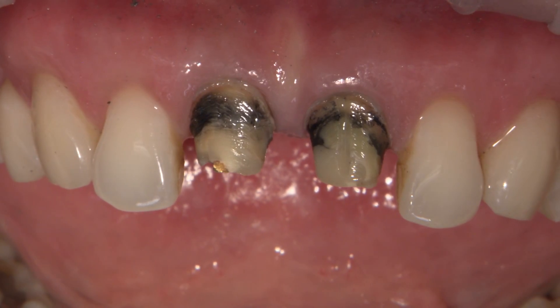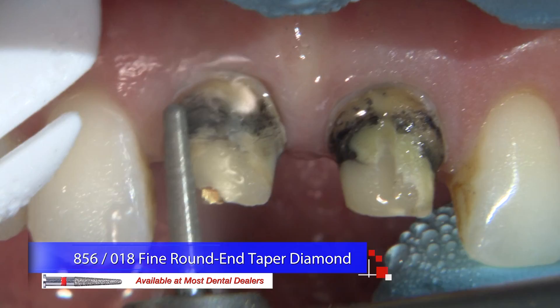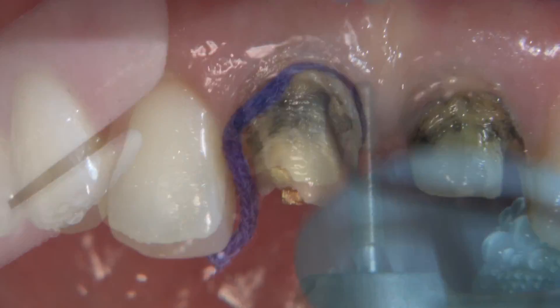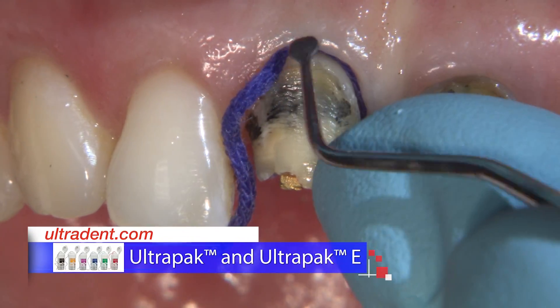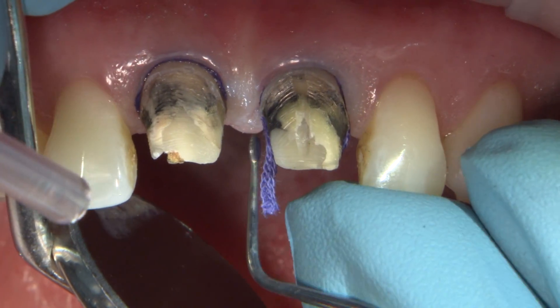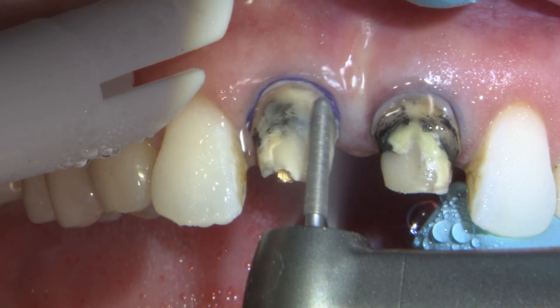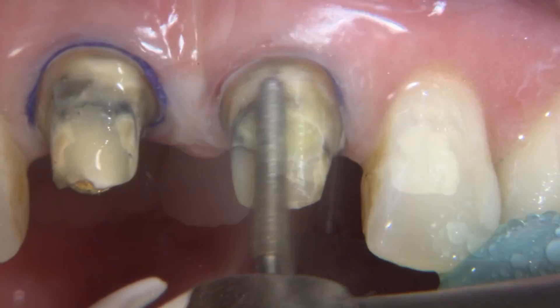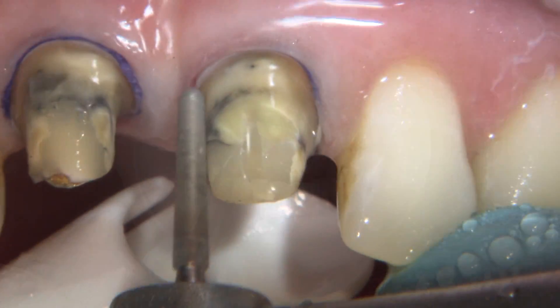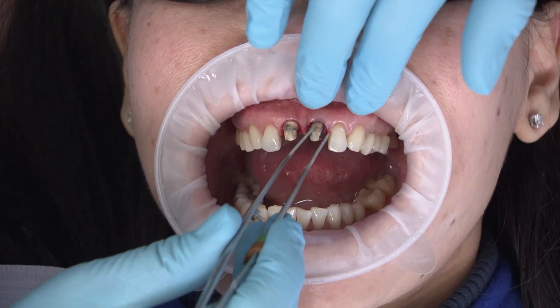Once the crowns are removed, she switches back to a round end tapered diamond 856-018 burr to smooth and refine the prep and establish a nice chamfered margin. Here she's packing a size zero cord down into the sulcus, which helps drop the gingival margins apically a bit so she can further reduce those gingival margins on the preps for a better aesthetic outcome for the future restorations. She then removes the cords, which should provide a good amount of tissue deflection to expose those margins, and prepares for the digital impression.